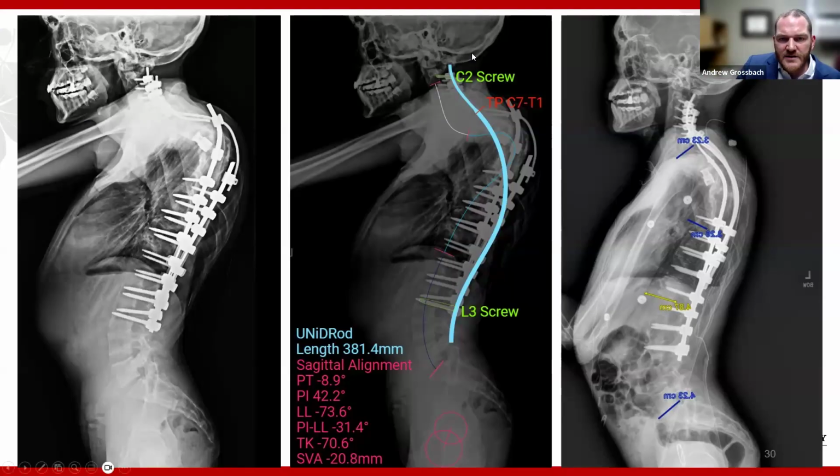And so you can see in the middle here, here's our plan. And so we plan to get this kyphosis better, and we have the 5-5 rod crossing where the apex of that kyphosis is. As you can see on the right here, the execution of our plan. And so fortunately for us, the cervical spine had fused solid. So I had multiple points of fixation in the cervical spine that was fused. And I could use these rods to cantilever basically that kyphosis to take that kyphosis out.